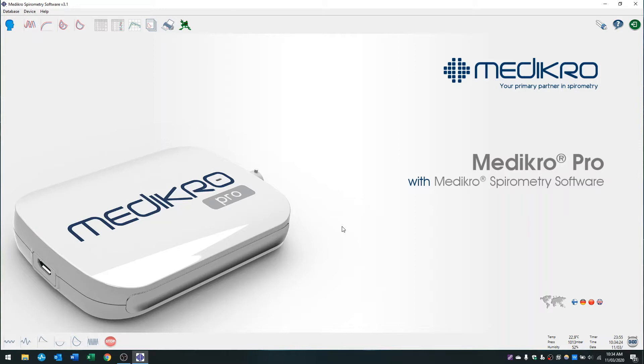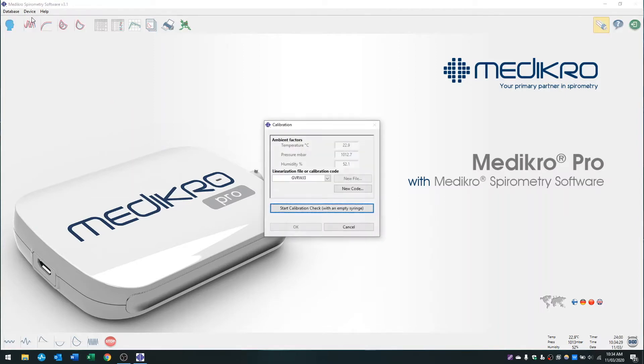Now we're ready to do our calibration. We want to go up to device at the top and press calibrate.